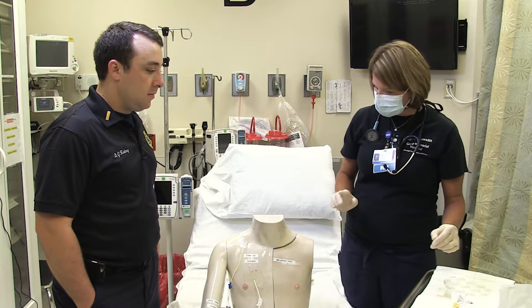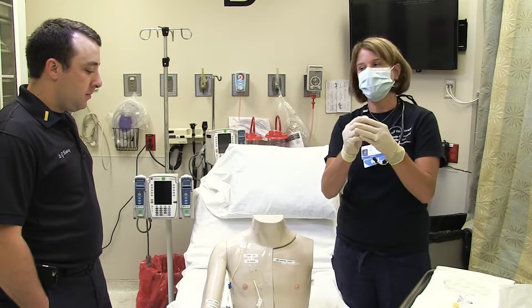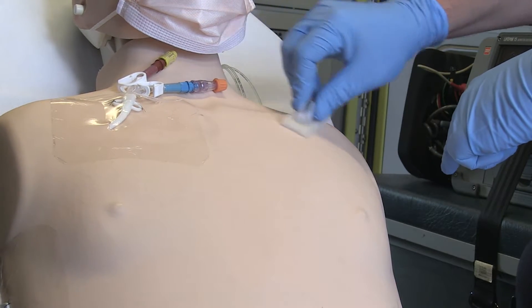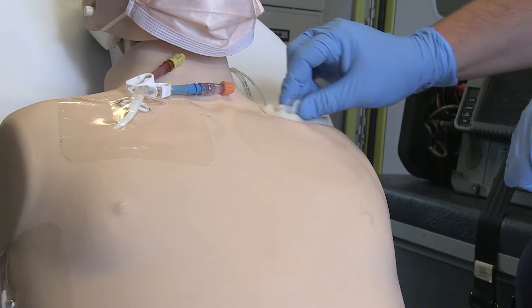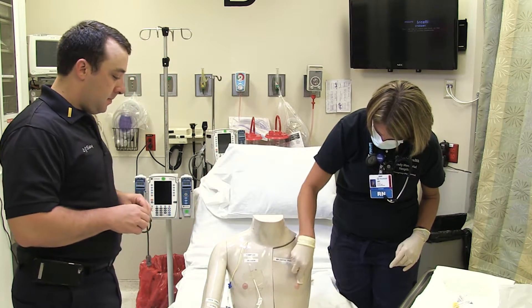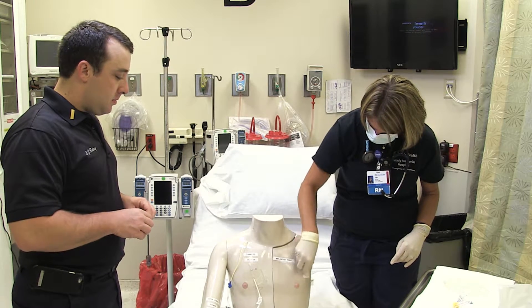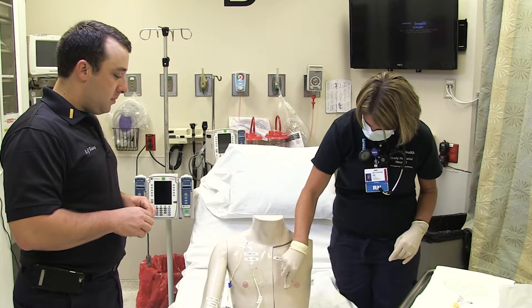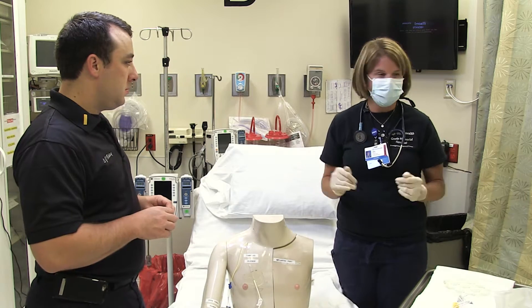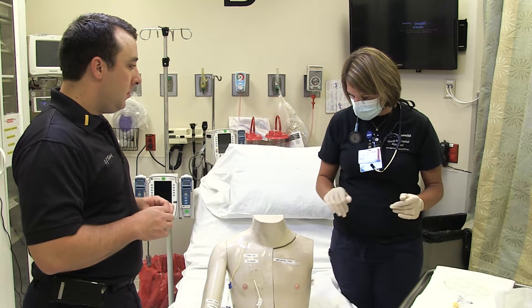Tell the patient to go ahead and turn their head away from the port. Take the chlorhexidine, break it open, feel where the port is, and start in the center — wipe out in a circular fashion, pushing down a little bit to get that liquid out there, spreading all the way out. This is now dirty, so put it on your non-sterile field. You do need to let this dry — if you don't let it dry, it's basically like you didn't use it. As much as we want to get in a hurry, you have to let it dry, usually about 30 to 45 seconds.